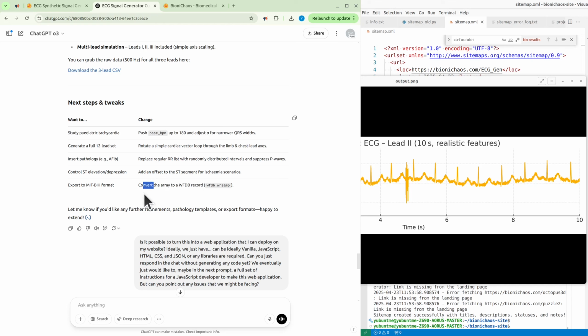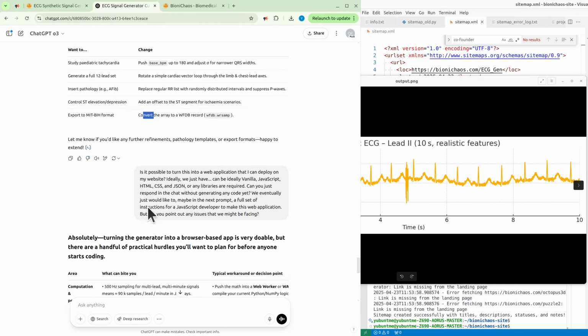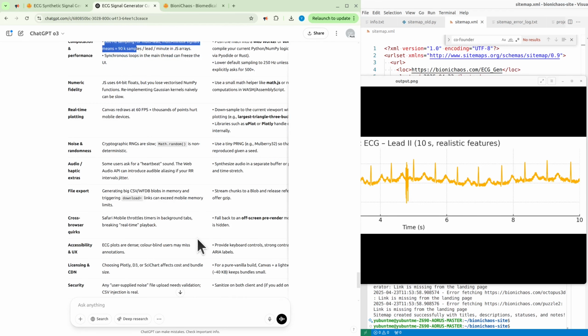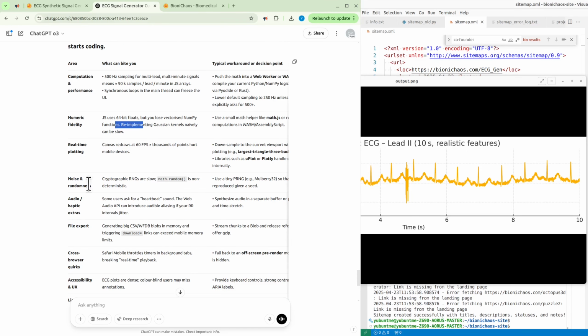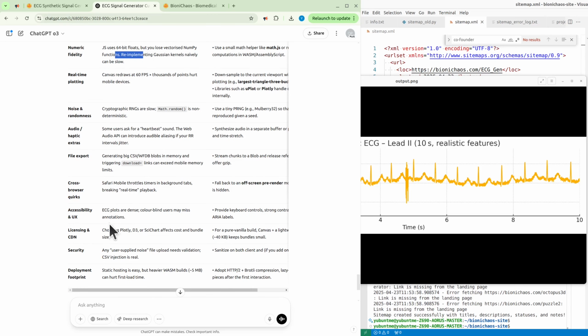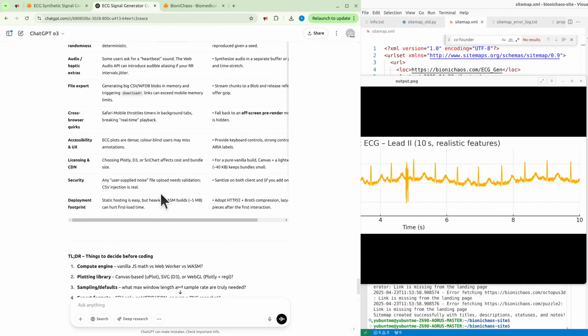And export in MITBIH format. Okay, we'll have the function to export. But the question now is if we can actually turn it into a web application. And yes, we might have a few issues with that, specifically with high sampling rate might slow things down. Yeah, we could potentially have other issues as well. Licensing, security, well, it's essentially open source, so you could see the code in the browser.